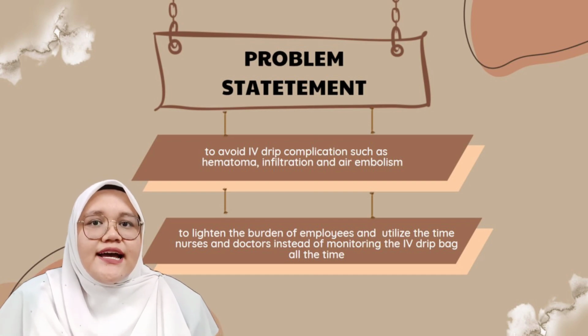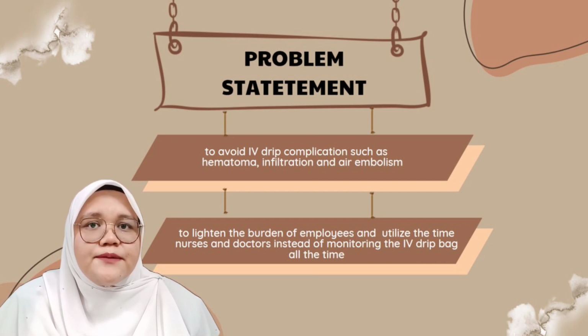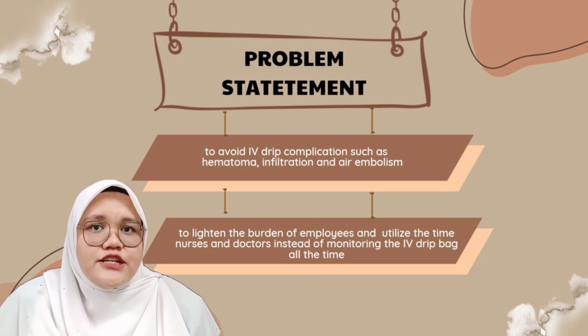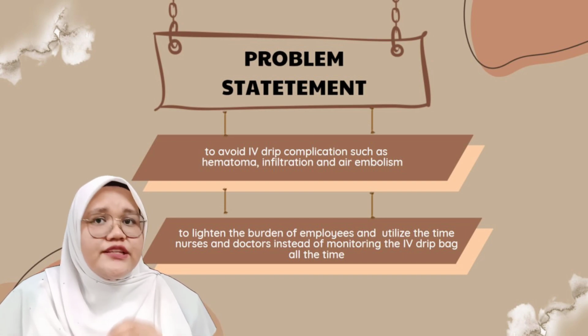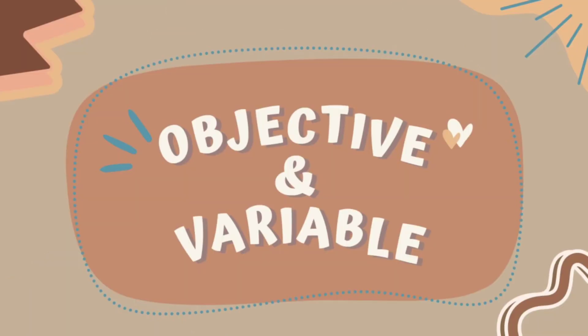Other than that, we want to lighten the burden of employees, which are nurses or doctors, and to better utilize the time of nurses and doctors instead of monitoring the IV drip bag all the time.